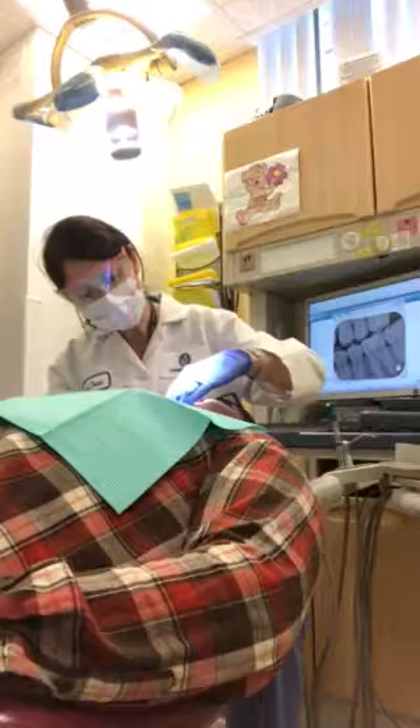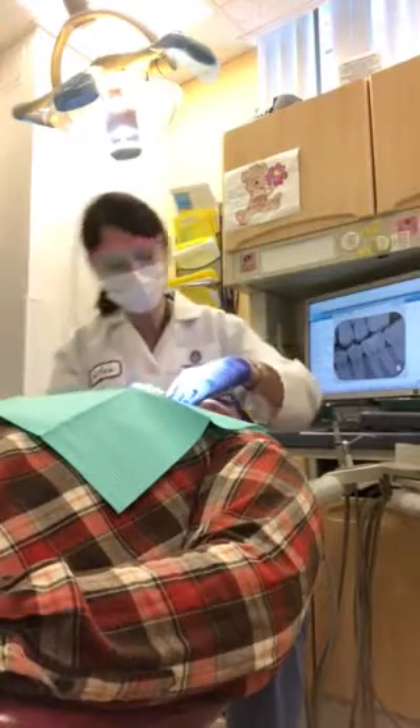And bite on your back teeth too. There we go. Perfect. Class one molar and canine on the right.